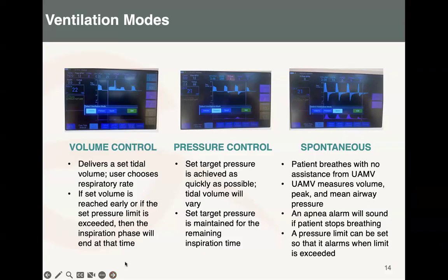When the patient goes apneic, the machine will sense it. If, for instance, you made a mistake and the patient did not really recover from the full muscle relaxant weaning off, or maybe the patient is too deep and becomes apneic or is delivering a low tidal volume, the machine has safety features that will give you an alarm to remind you that something is wrong here. When you go check, you can either find the patient is apneic or has a low tidal volume, then you have to take it up and do the right thing.